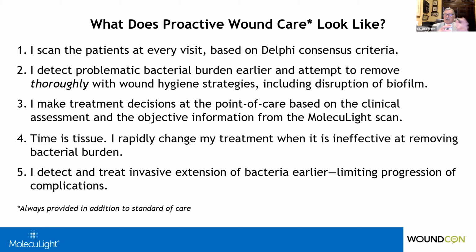And as I mentioned, we create patient folders in the scanner, and it's very easy for us to just thumb through that. They can see where they started. They can see the progression of their wound and where they are on that particular clinic day. I personally think that it supports not only patient involvement, but I think patients are more likely to be adherent or follow the physician's instructions.